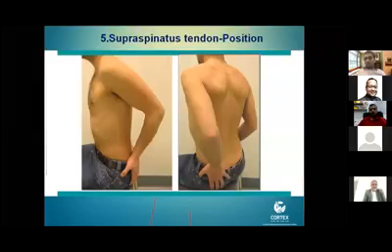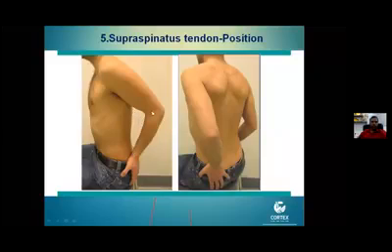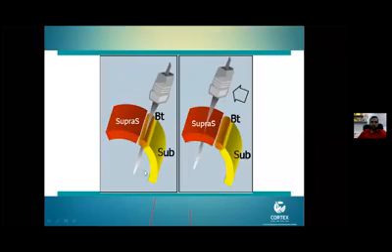After assessing the anterior medial aspects, we go to the supraspinatus tendon, which is the most common tendon injured in the shoulder, either by tendinitis or by tear. So we should be assessing this tendon in detail. The most important part is that it is normally situated under the acromion. So we use the modified Crass position, or hand in back pocket position. Here we move the elbow posteriorly and internally rotate the arm, in a backward position. You can see this position. By keeping this, the supraspinatus comes out from under the acromion.